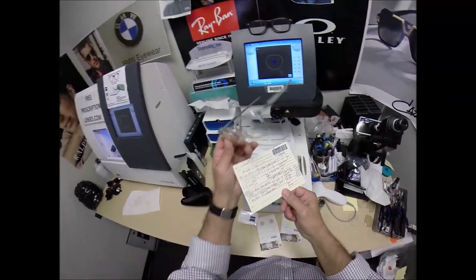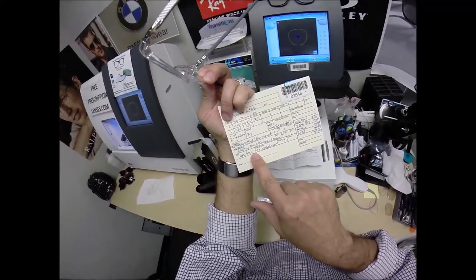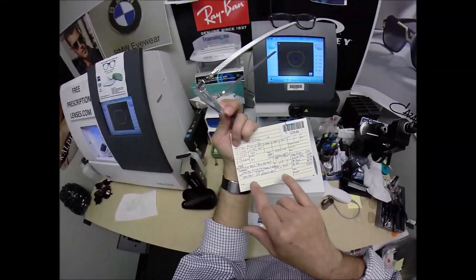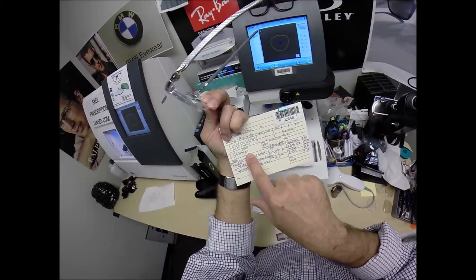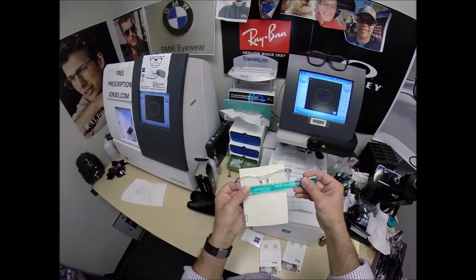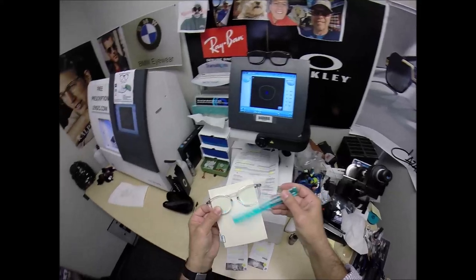Now I'm going to measure the pupillary distance, 33.5 for each eye is a total of 67. PD is 67, optical center height of 24. So I'm going to turn the card around, place the PD stick against my thumb, and when I hold it up to the left lens, we're getting 67 millimeters.